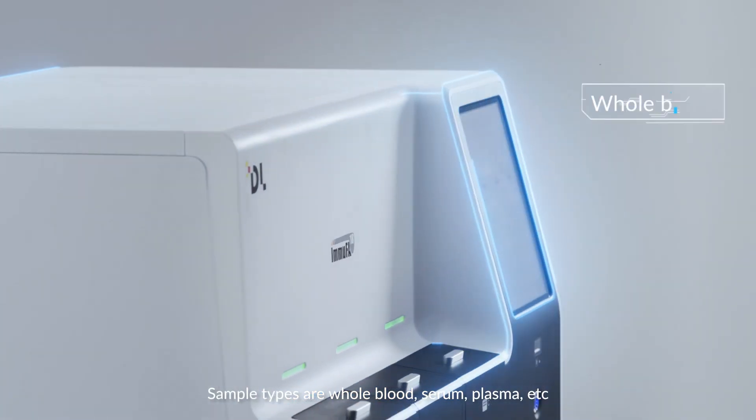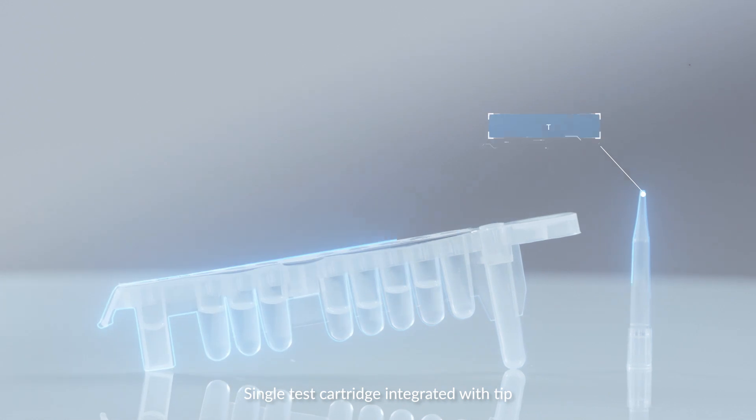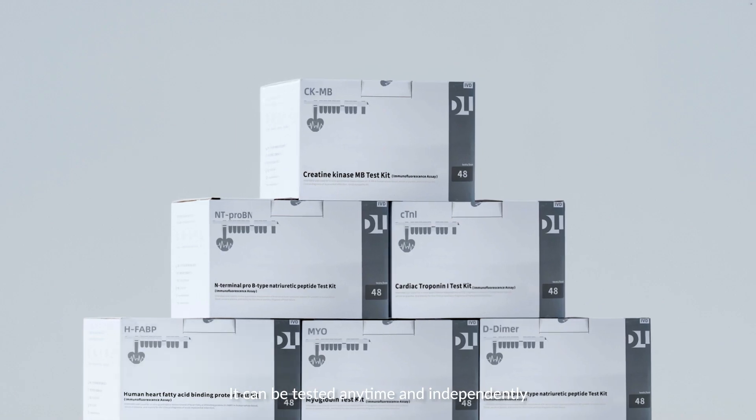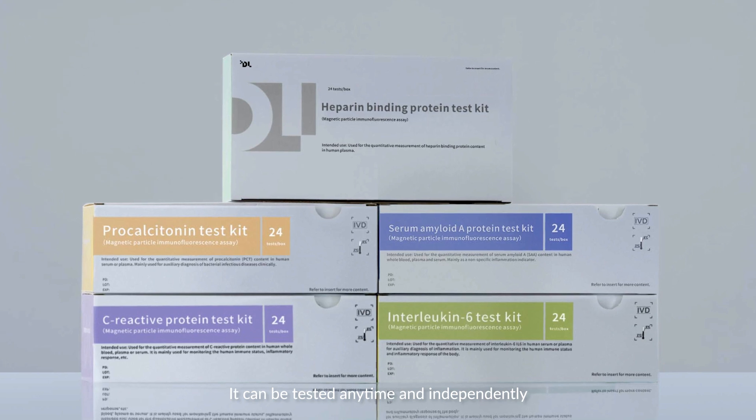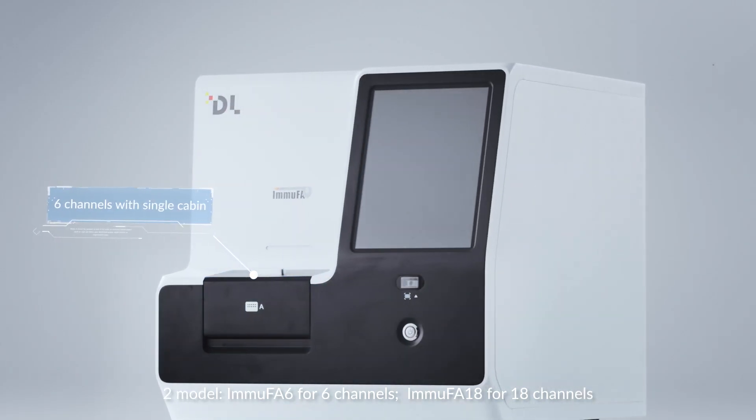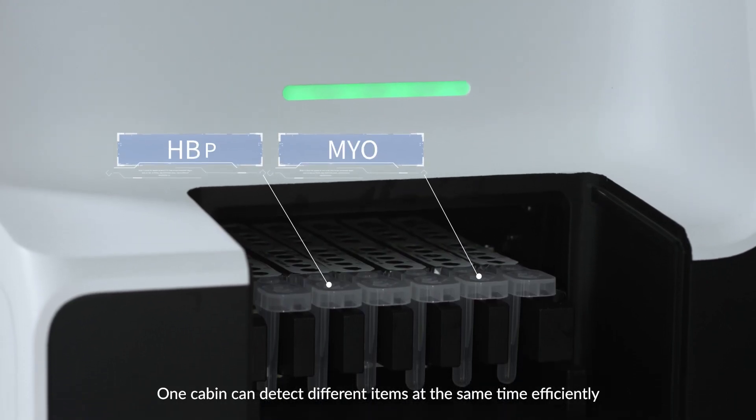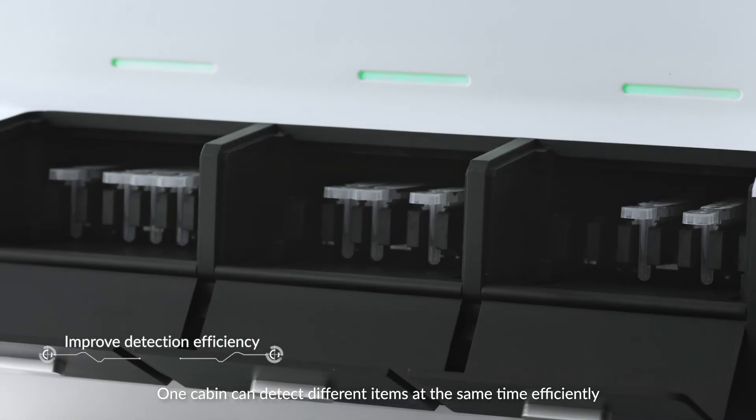Sample types include whole blood, serum, plasma, etc. Single test the cartridge with tip. It can be tested anytime and independently. There are two models: ImmuFA6 for 6 channels, ImmuFA18 for 18 channels. One cabin can detect different items at the same time efficiently.